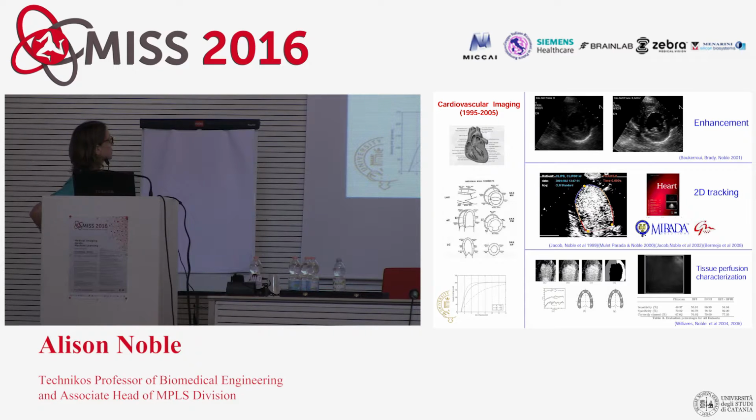So in ultrasound, you move the probe around to find these views, and then clinical practice today will be able to do visual scoring, or possibly using a small amount of automated tools to look at wall motion, or inject contrast agents that allow you to look at tissue perfusion.